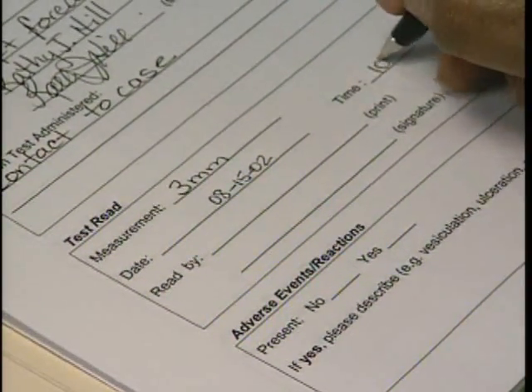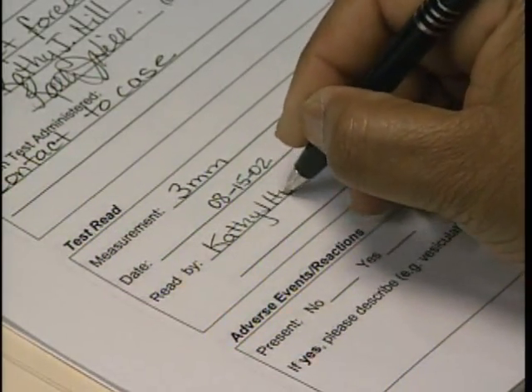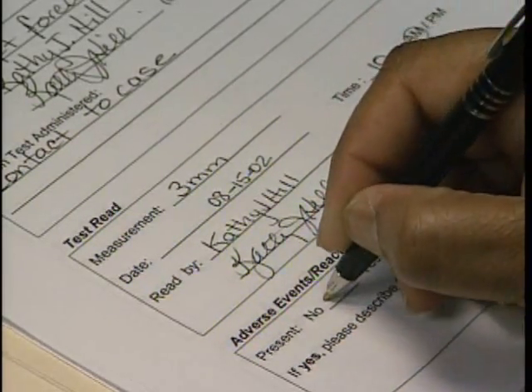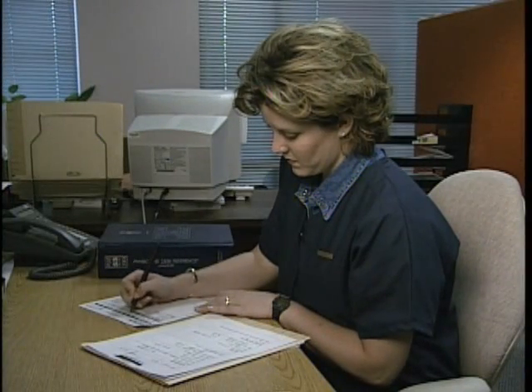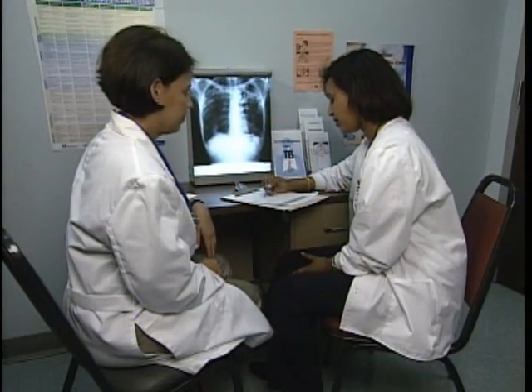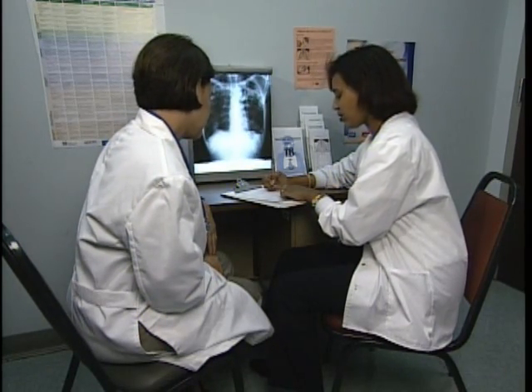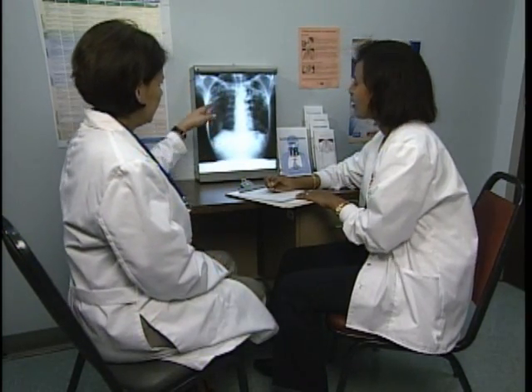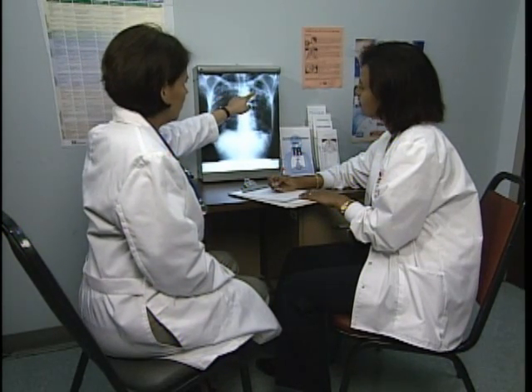Additional information should include the date and time the test was read, the name and signature of the person who read the skin test, and the presence or absence of adverse effects. State or local policies may require additional documentation of adverse effects. Accurately reading and recording skin test measurement results is important and gives the healthcare provider useful information for evaluation. Results are often used as a baseline or as a comparison with past or future test results.